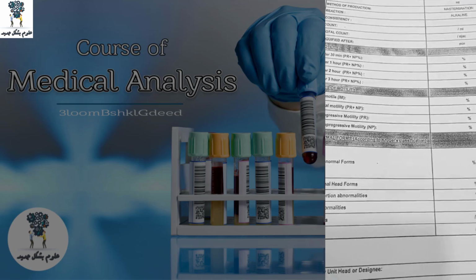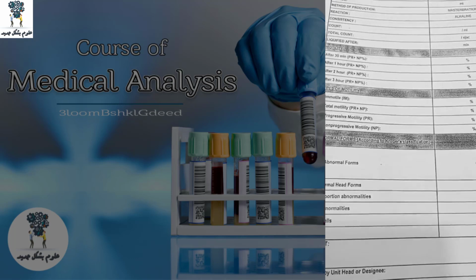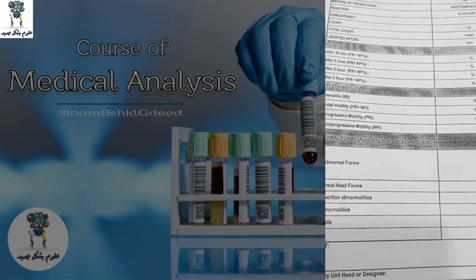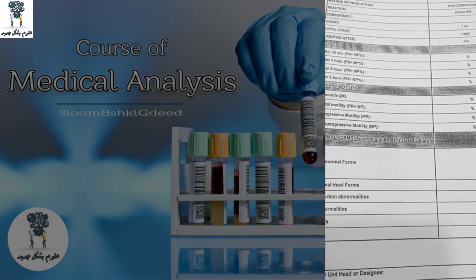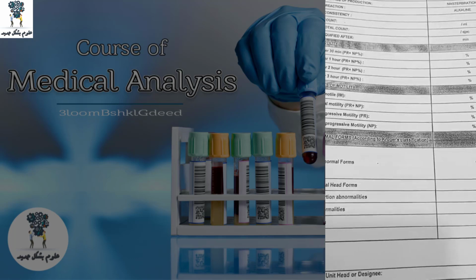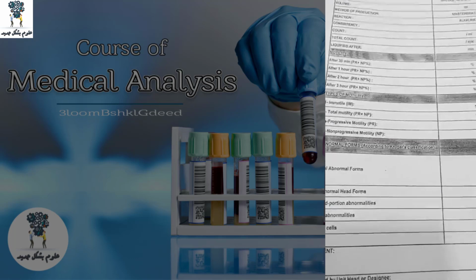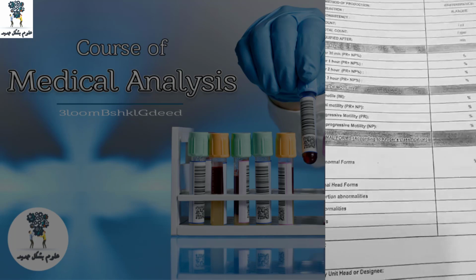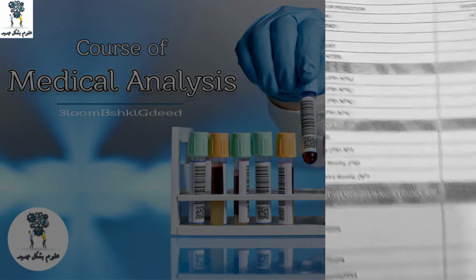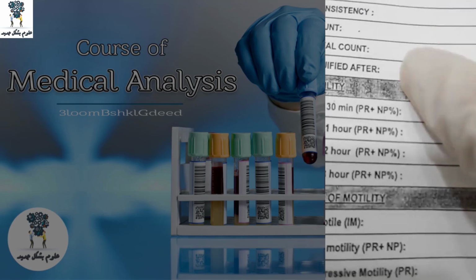طيب احنا بنعمل إيه لو ما فكتش مننا؟ بنسميها الفك، بنعمل حاجة اسمها ميكانيكال فك، أو نقعد نحاول نفكها بالبايبيتنج، نعمل ميكسينج بالبايبات. So in this case بنحولها إلى ليكويد عشان نقدر نحللها. طيب في جزئية احنا عايزين نشدد عليها أو نشوفها مع بعض، هي كلمة liquefied after.